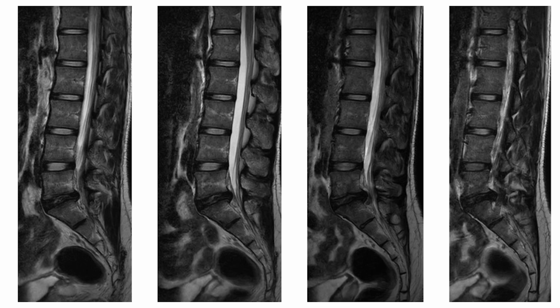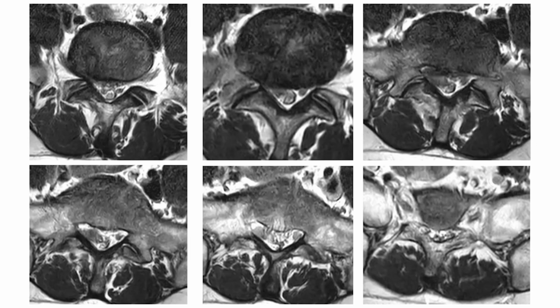So here in a sagittal MRI you can see that there is a disc prolapse at L5-S1 with a sequestrated fragment on the right side. If you go through the axial MRIs, again there is a right-sided disc prolapse with the sequestrated fragment pushing the root laterally here.